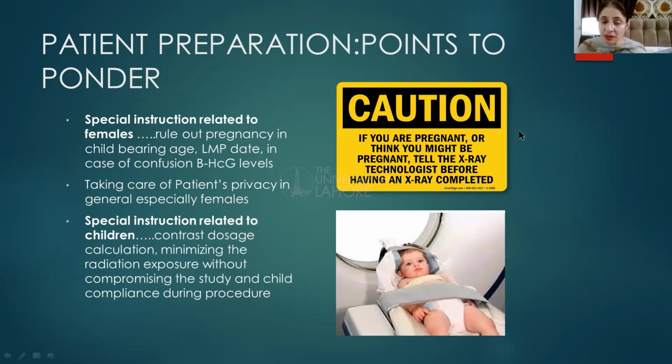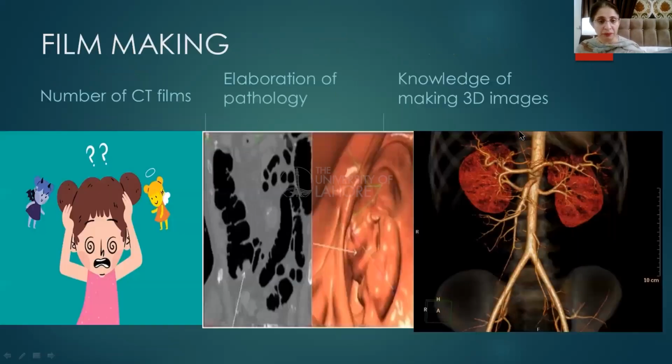And where the need is required, which is most of the time, sedation should be given to the patient, but that should be done under strict monitoring by the doctor. So these are the two important situations that should be kept in mind while performing CT imaging. This is the most important slide.